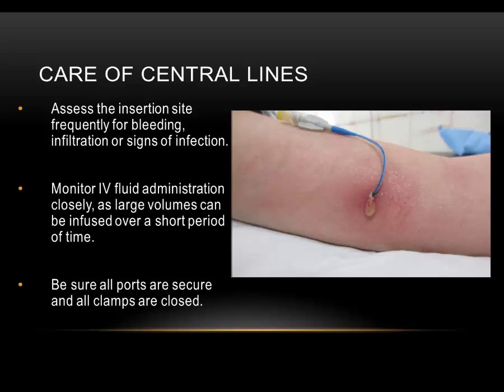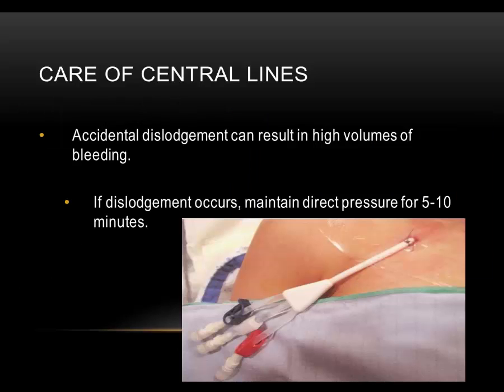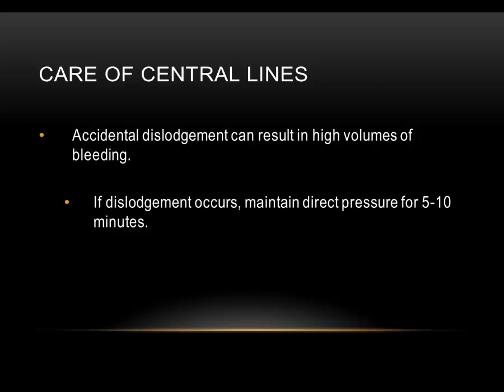Don't allow the patients to baby their arm. Normal use increases the blood circulation to the arm. Never pull on the catheter and protect the lumen so they don't get caught on anything. Be sure to monitor your infusion rate. Dislodgement of central lines or PICC lines can cause excessive bleeding. You need to hold direct pressure for 5 to 10 minutes to ensure the bleeding has stopped.